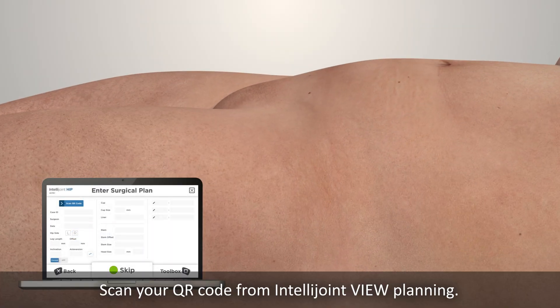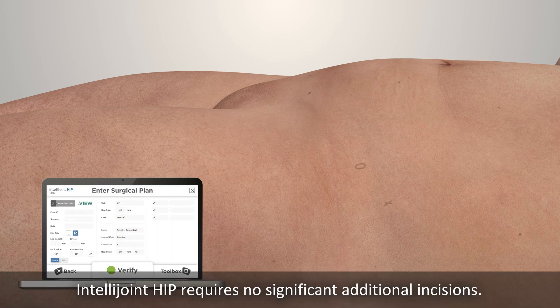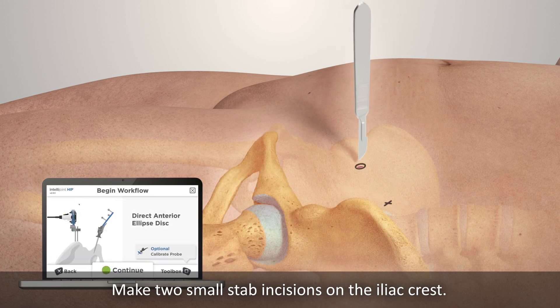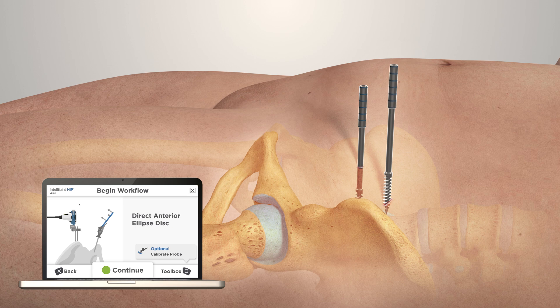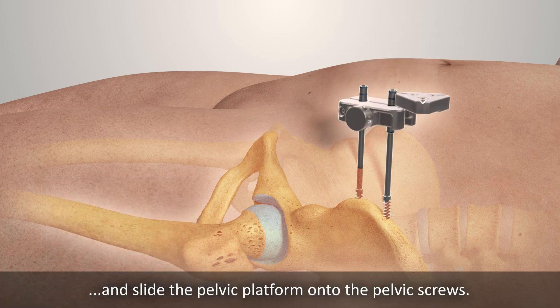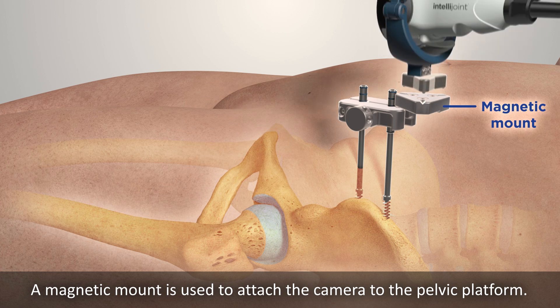Scan your QR code from IntelliJoint View Planning. IntelliJoint Hip requires no significant additional incisions. Make two small stab incisions on the iliac crest. Insert self-tapping screws into the pelvis, and slide the pelvic platform onto the pelvic screws. A magnetic mount is used to attach the camera to the pelvic platform.